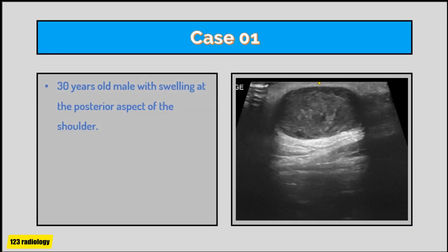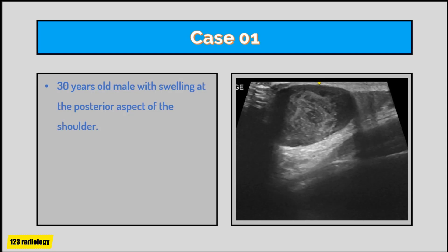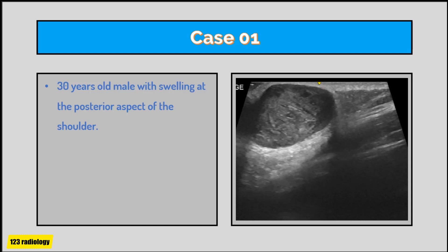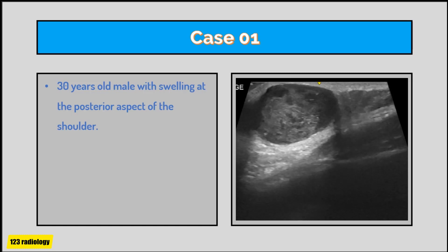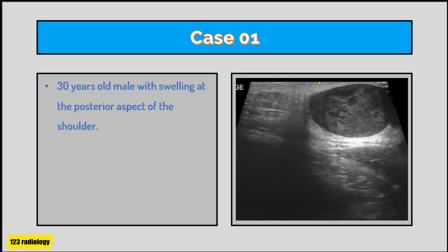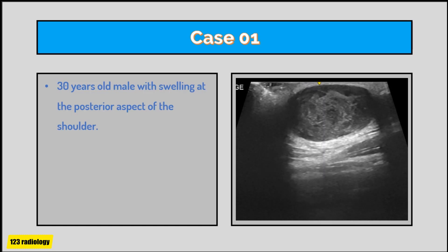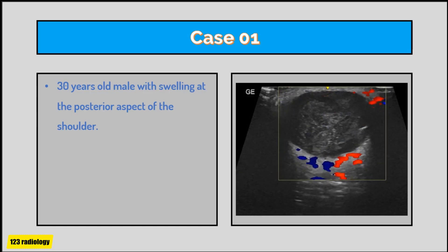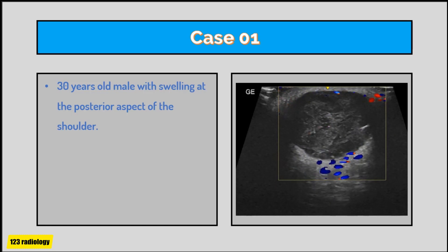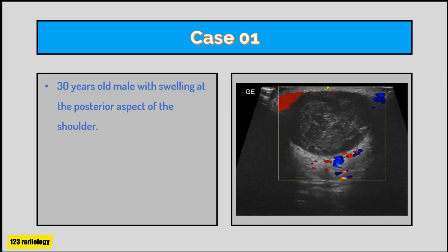Case number one: a 30-year-old male with swelling at the posterior aspect of the shoulder. As seen in this cine clip, there is a hypoechoic oval-shaped lesion with dermal attachment and subcutaneous location. The lesion shows heterogeneous echo texture with well-defined margins and posterior acoustic enhancement. On color Doppler examination there is no internal flow. These ultrasound features are highly suggestive of epidermal inclusion cyst, and the diagnosis was confirmed by histopathology.